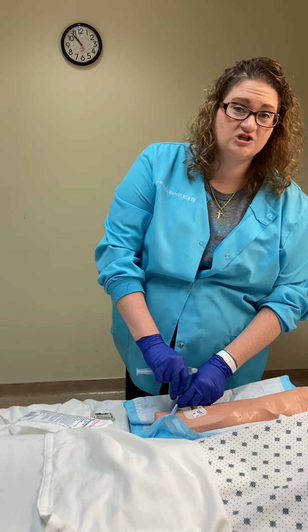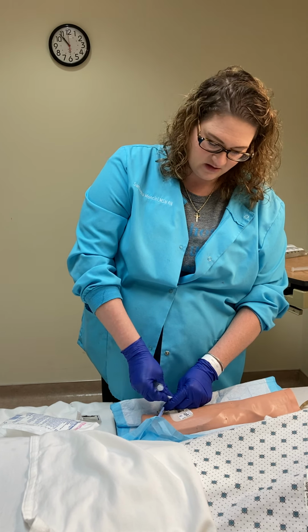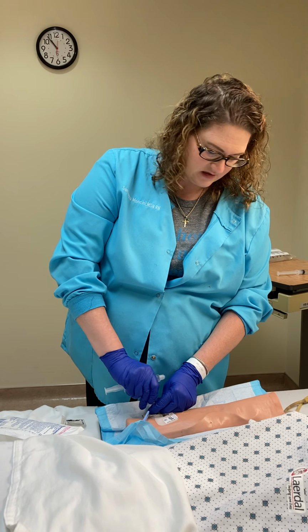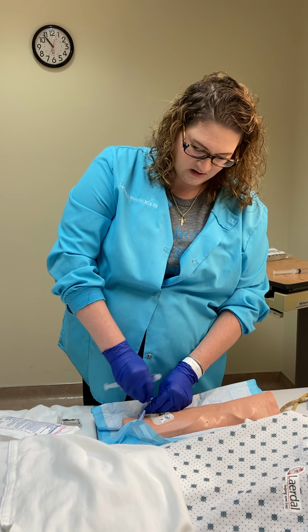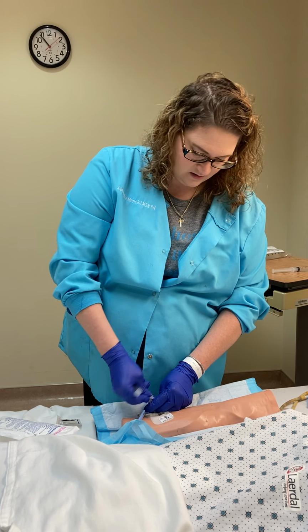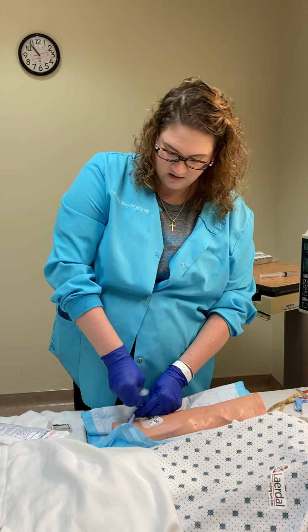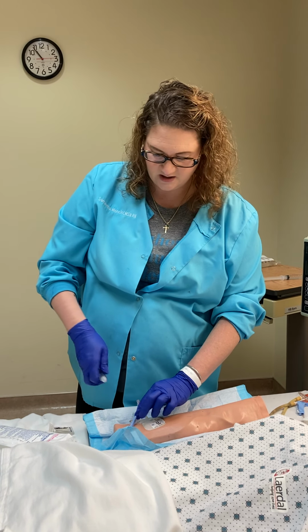And I'm going to flush just to make sure that there's no infiltration or pain. Scrubbing for 15 seconds, and allowing it to dry.